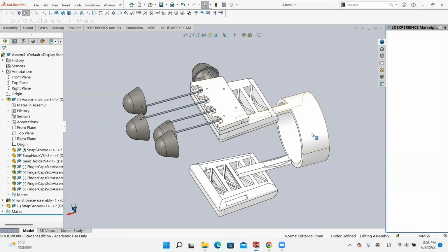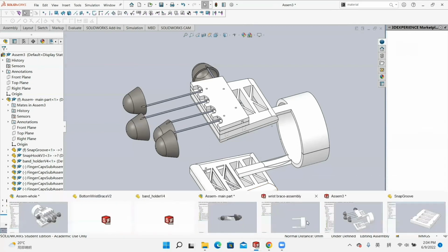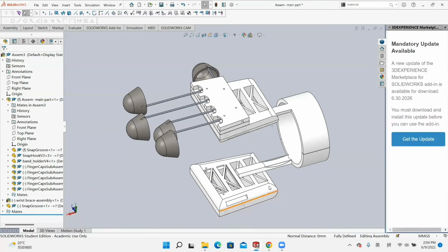And the second part is the wrist press part, which will provide us the ability to let the frame part fit in your hand. And the reason why we have another frame part at the bottom of the assembly is because we want our project to be functional at both the back of the hand and the palm. So let's introduce the specific mates separately.